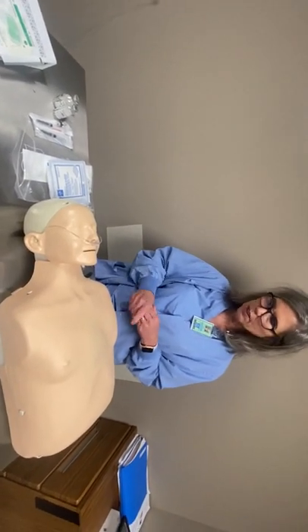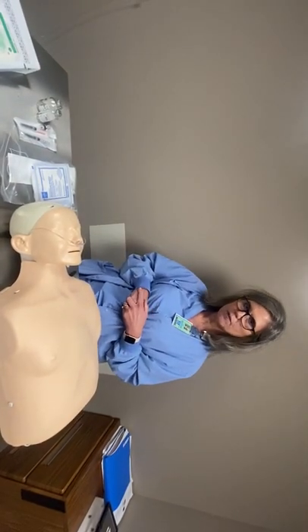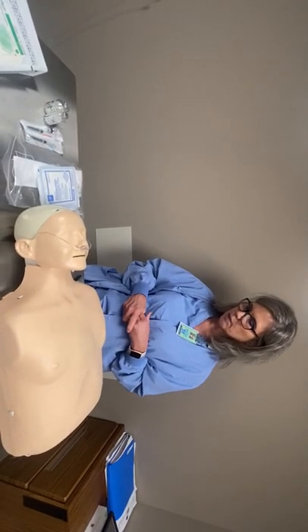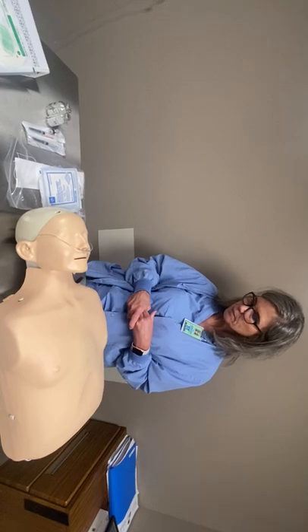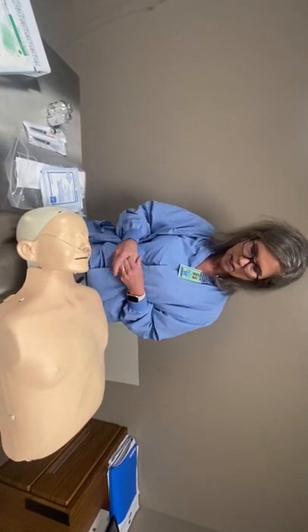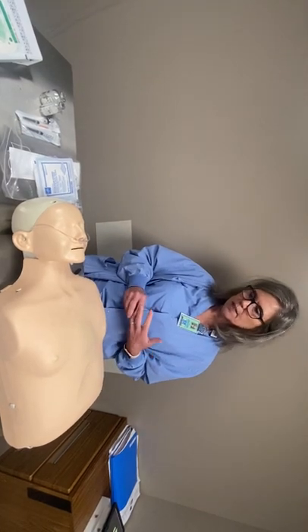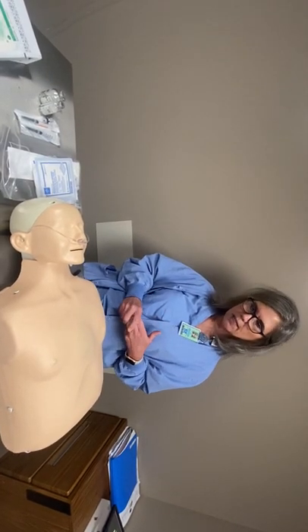Once you have the patient all ready, set your monitor for every 15 minutes for vital signs and blood pressure — it'll be continuous pulse oximetry. Call your anesthesiologist in. When they arrive, you do a timeout: name, date of birth, what procedure we're doing, and any allergies.